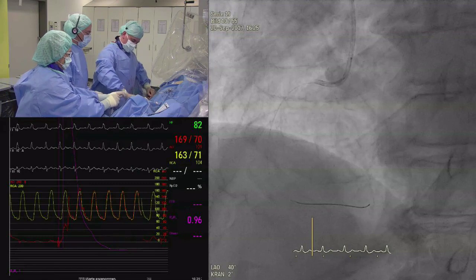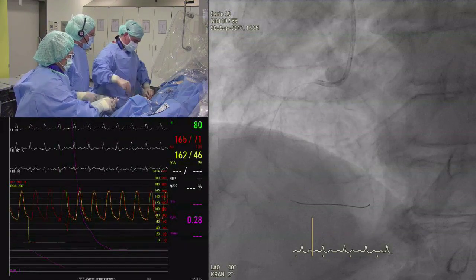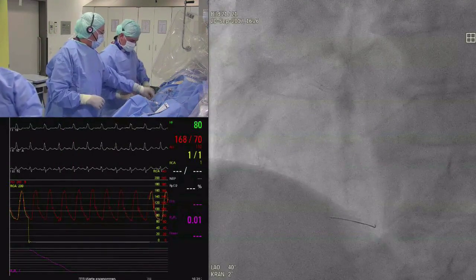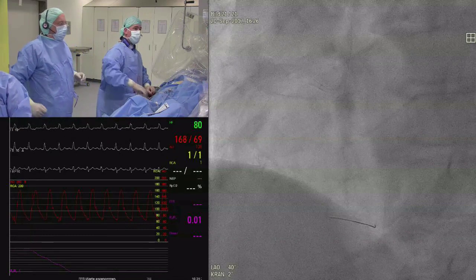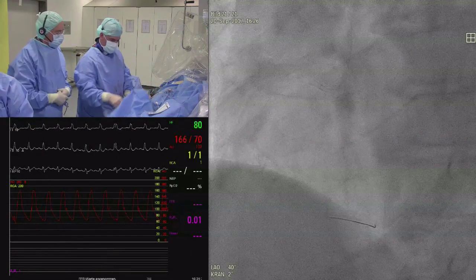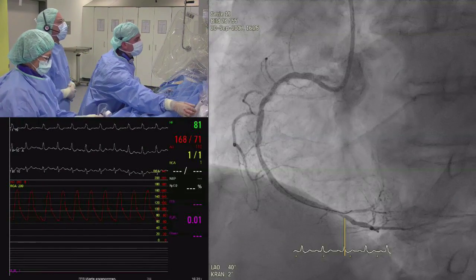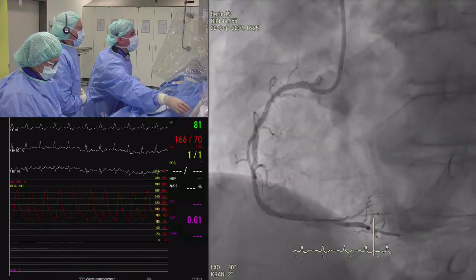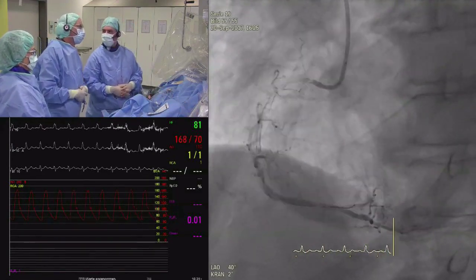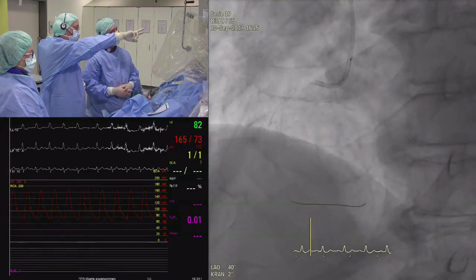Another piece of information is that after ballooning, we can induce reactive hyperemia by the balloon. Yes, right? So we can get the FFR value very, very easily, just putting the balloon to the guiding catheter and making sure the guiding is not wedged. Probably the 30 seconds balloon inflation with the non-compliant balloon causes a 30 seconds hyperemic duration also, right? Yeah. So probably we can get that.